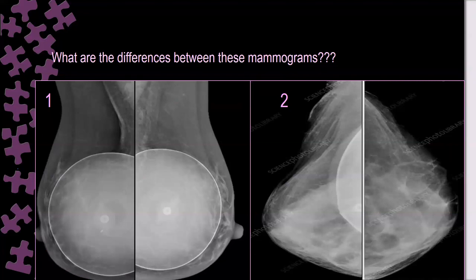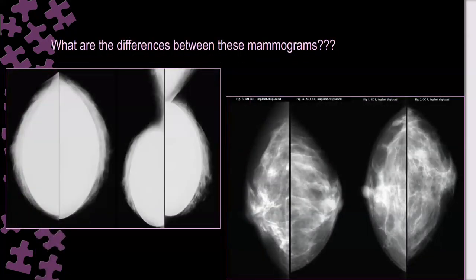What is the difference between these two images? Let us go quick. Most of the lecture is still ahead. We still have a lot of techniques to cover for imaging the breast. Hint? What did you say? The first one is Eklund. Excellent, you are right.